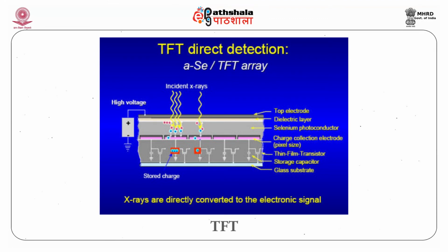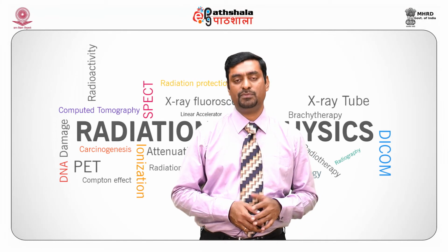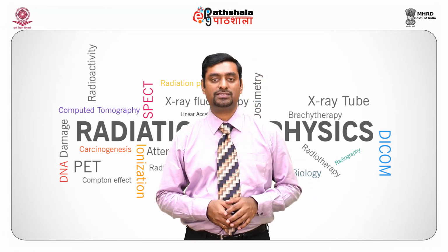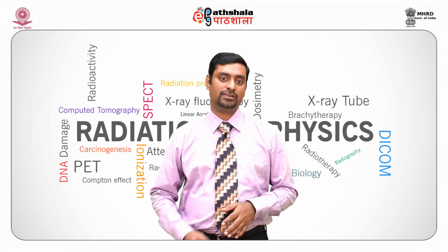So X-rays here are directly converted into an electronic signal. What's the advantage of a direct flat panel detector? It has high spatial resolution, very close to a film screen combination, and has a field of view of approximately 25 by 29 centimeters. Pixel size can be up to 70 microns. Obviously, we need to see microcalcification, which is about 100 microns. Hence, this fits in with 70 microns. It is possible to get a good image quality.